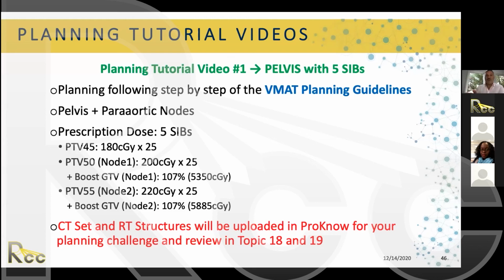We're not telling you to do exactly as we told you, but the good thing is that when we review these plans in the next topics, 18 and 19, one next week and the next one at the beginning of January, it will be nice for everybody to share their experience. Like, for example, I was constraining the parotid too much and I noticed this, and then I did this trick to change it. So we want you to follow these planning guidelines, but also be conscious of adding your own experience too. But for these two cases, just start with these guidelines, okay?